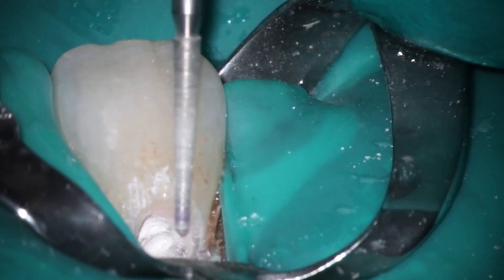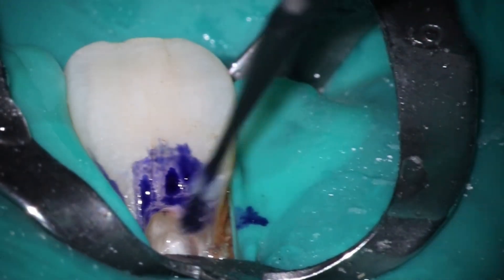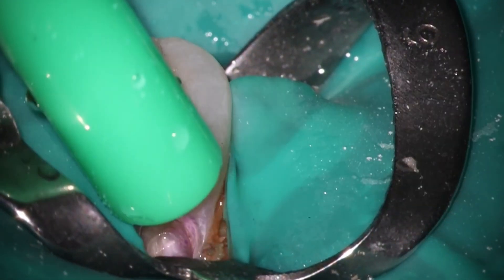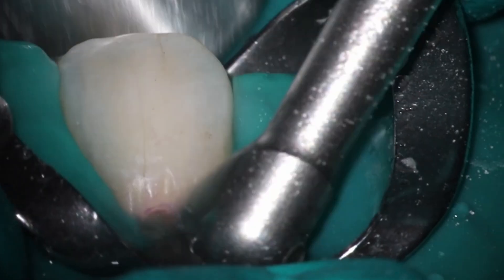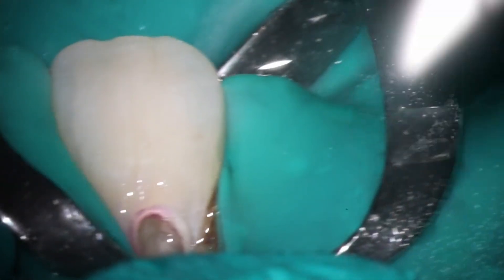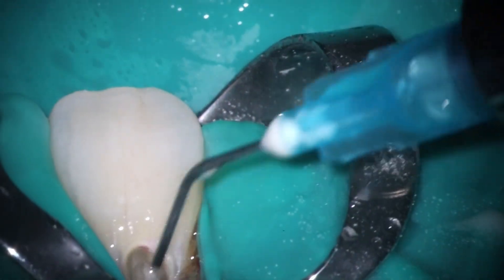So this is a shout out to Dr. Geisberger from UOP — using those little areas you can almost create these little divots. What that does is hide the transition from the composite to the tooth itself, so it almost looks like little mamelons or little developmental grooves inside that area. What that does is it hides the transition from the composite to the actual tooth structure, because any sharp lines or really obvious things like that are going to catch the eye. Because this is his front tooth and everything else looks completely natural, I want to make sure this has the best chance. So we're going back in blasting again, getting that all cleaned out to make sure we get a really solid seal. And you can see finally we're looking good down at that apical area, so we're going to dry this and make sure we get that nice bonding process started.